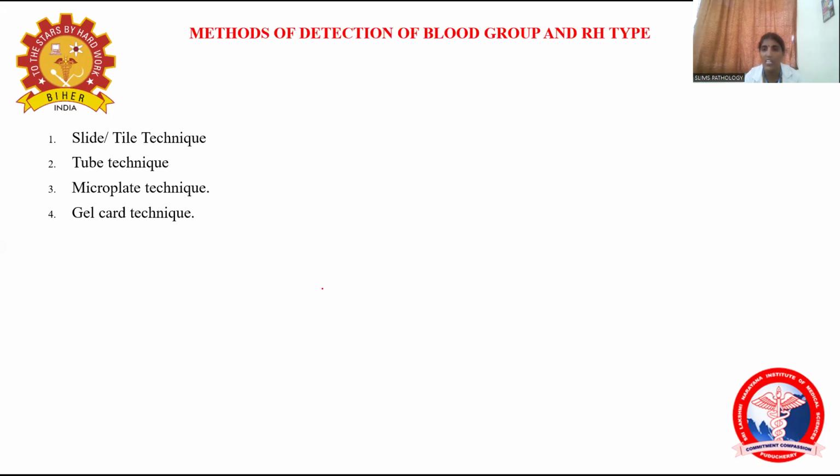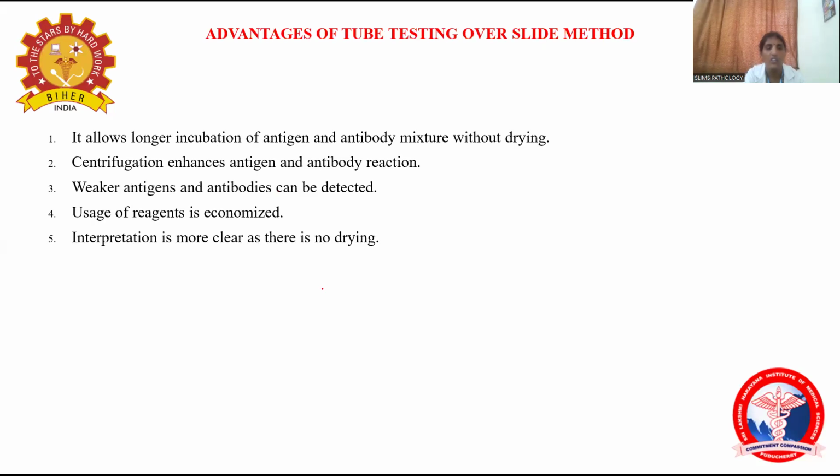And then finally, the gel card technique, which is one of the currently used methodologies, right? The gel card technique is one of the most useful and very sensitive methods, and you can even store and document the report in the same manner as a gel card. For your level, at least just know these are the methods. At least four methods you have to know. What are those? Number one, slide, tube, microplate, gel card technique.